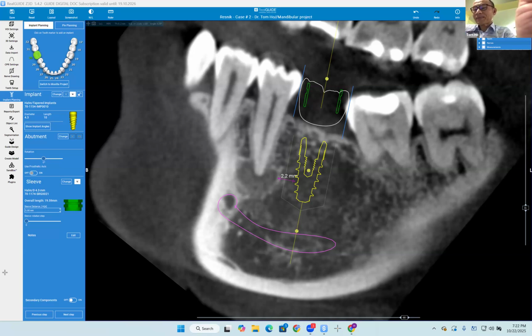Okay, great. And another little tip, Doc, Dr. Hussein, you see those little blue lines there? Do some guide planes, and then you'll have one path of insertion when you put the crown in. Okay, great. Beautiful. Thank you. So just do the root canal first.